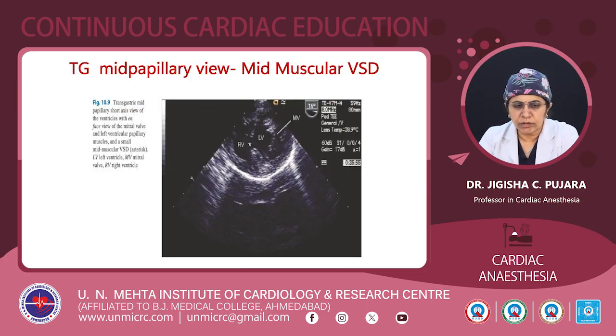Here you can see the transgastric mid-papillary view, where a mid-muscular VSD, with the asterisk, can be seen.